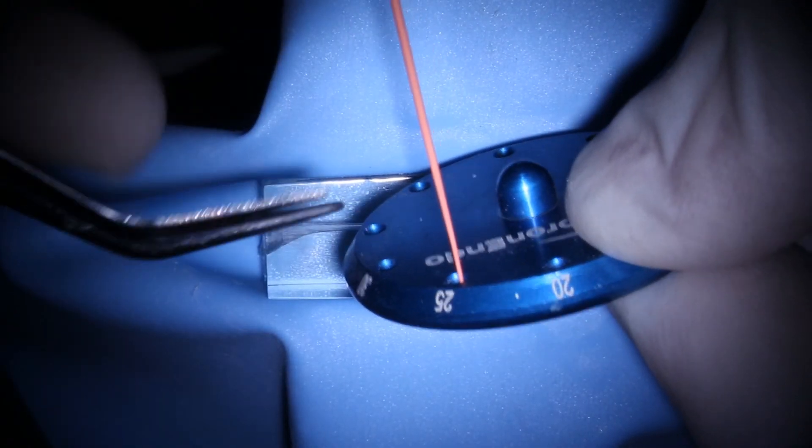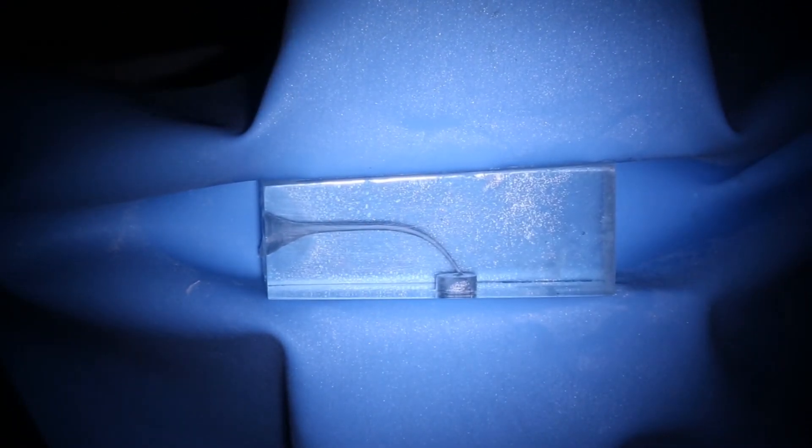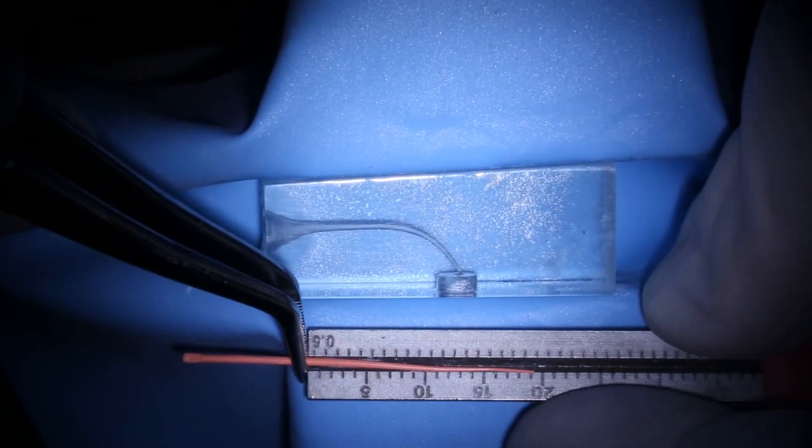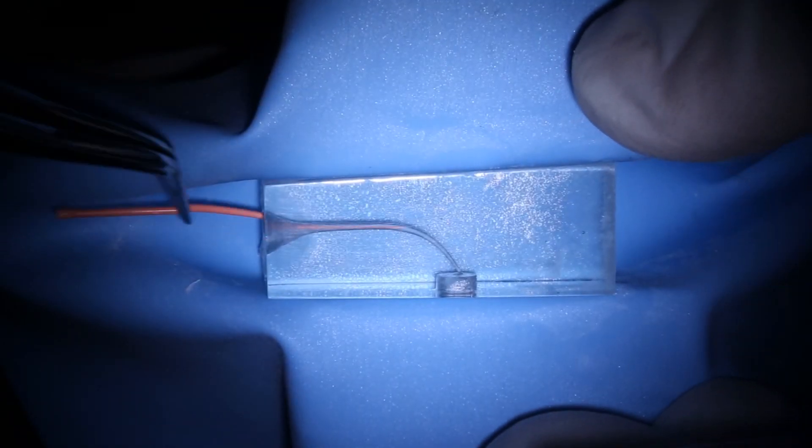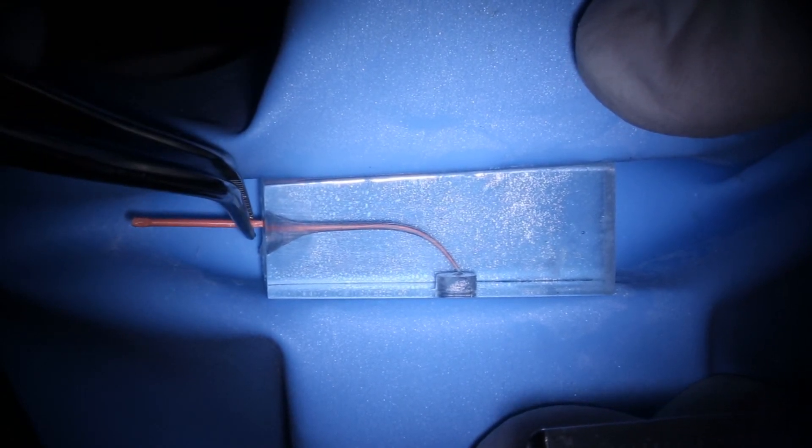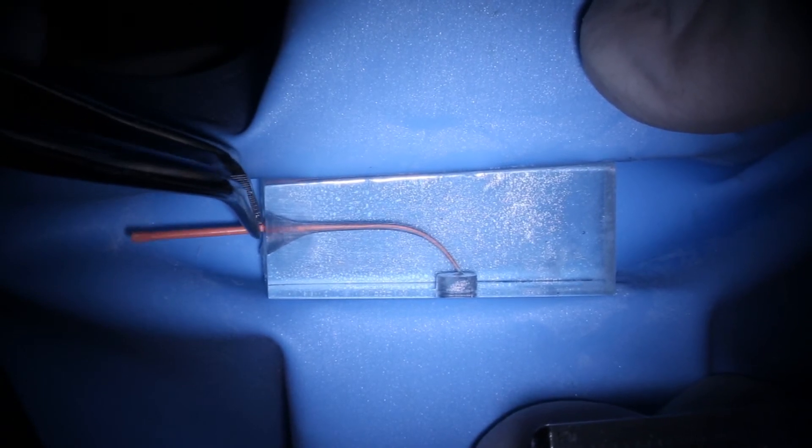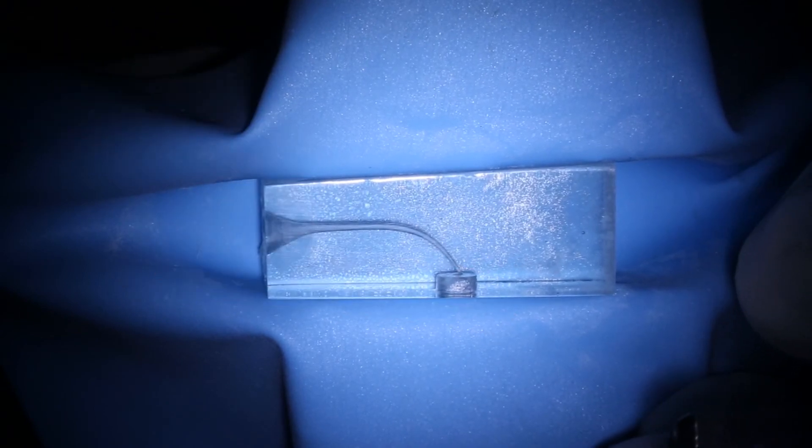And then we run this blade over the top of that, and it trims off that excess. So it leaves us with a medium fine cone, which is now trimmed to 25 apex. So again, we'll just measure this to our working length, which is 18.5, and try this in. And in this case, we can have that seat to our prep. So that's one way to get a cone to fit. Now we don't have the 20V, we can use a medium fine cone trimmed.